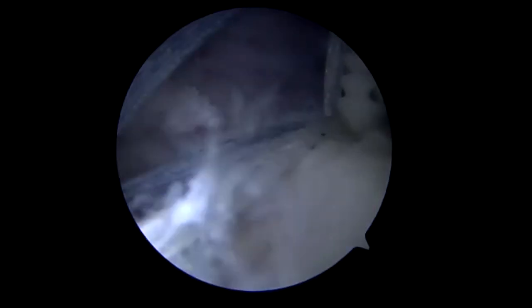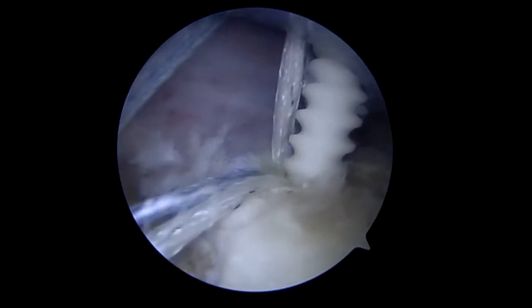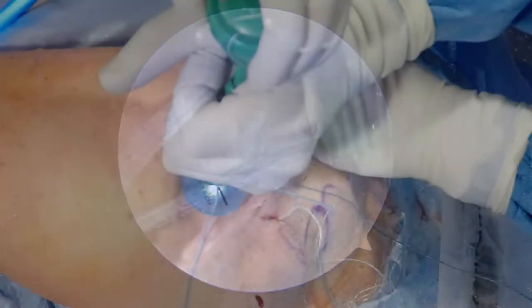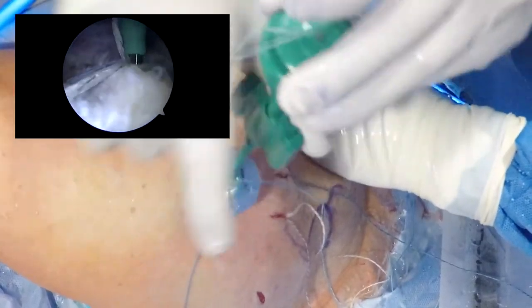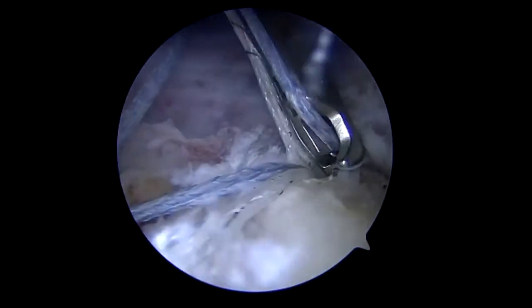We will soon see the lateral graft being brought down to the tuberosity, and again we're quite lateral here. You can see fat droplets and the graft is inserted with good tension. We'll spin back the inserter and ensure there's a good purchase before we cut the sutures.